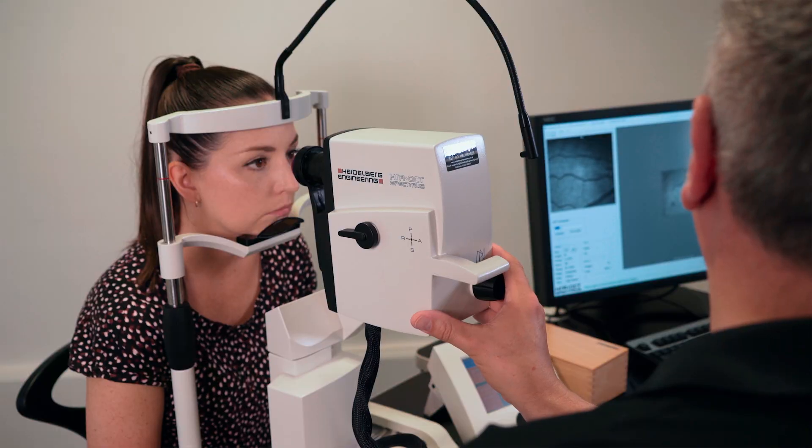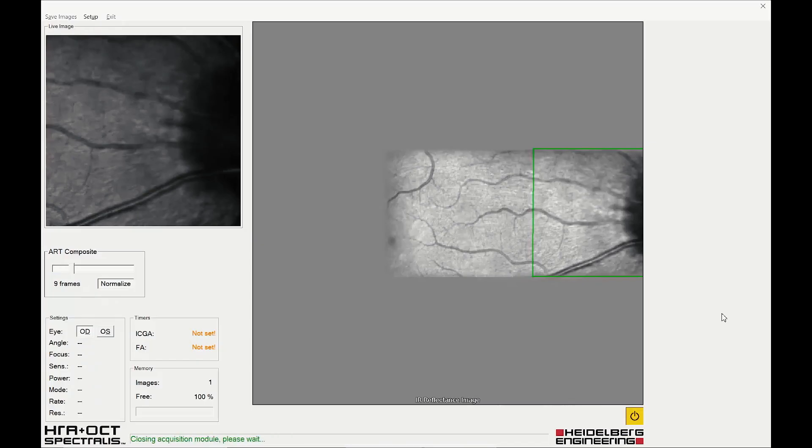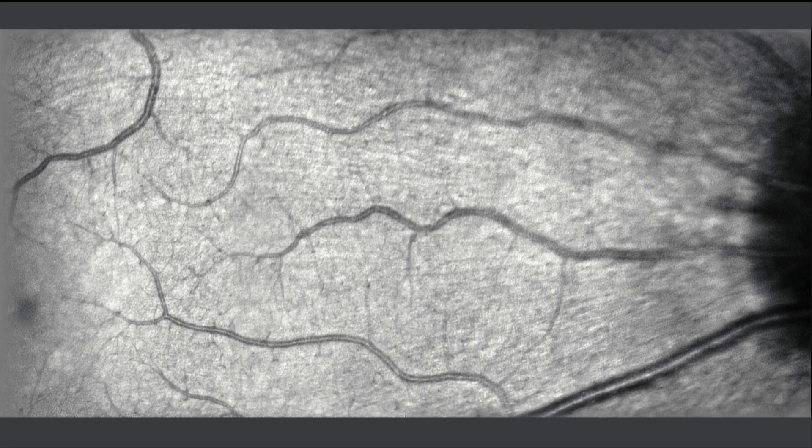When sufficient retina has been visualized, acquire an image. Exit and save. The resulting image provides a panoramic but high resolution image of the fundus.